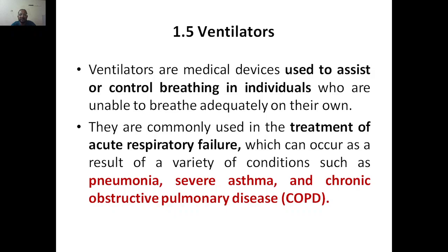There was a huge demand for ventilators during COVID time, because of the collapsing of the lung due to the inflammation or infection by the COVID-19 virus, which made it a very difficult era to pass through. So ventilators were used widely to support the lung in doing its mechanism, like the gas exchange mechanism.